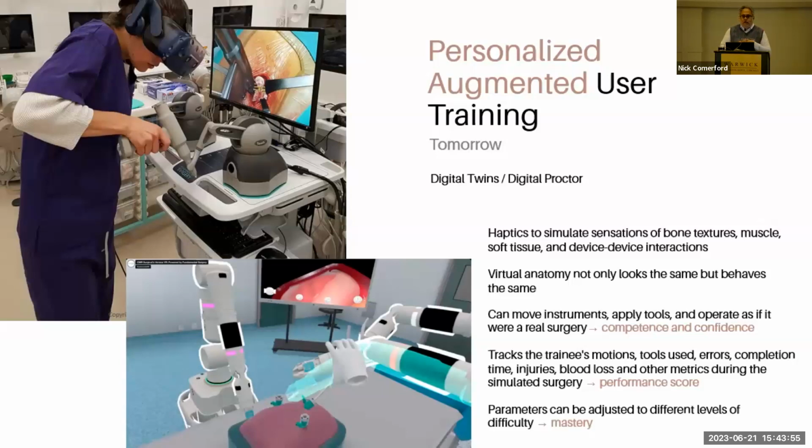You see more of this now in robotic surgeries, where with a lot of the robotic surgical systems you have to go through training certifications, and their training devices are used. Those training devices are big and expensive. So one area you see this getting a lot of adoption these days is in robotic surgical systems, because it really does accelerate that certification program.